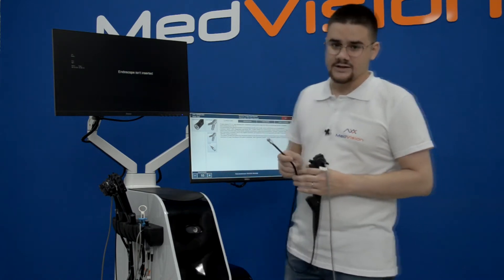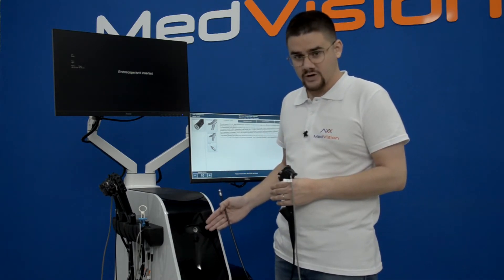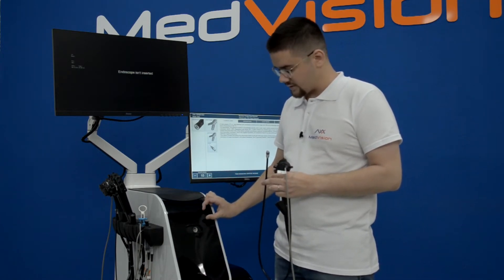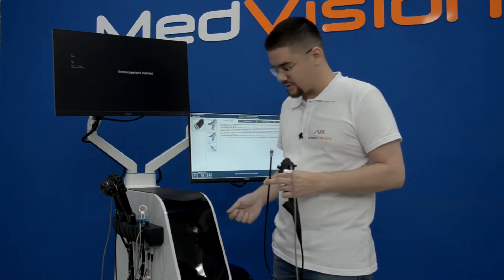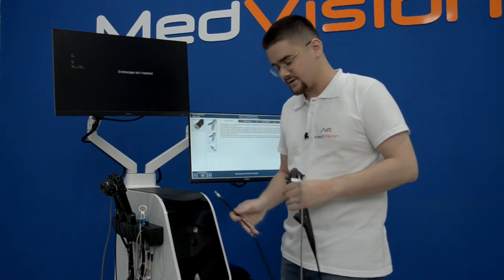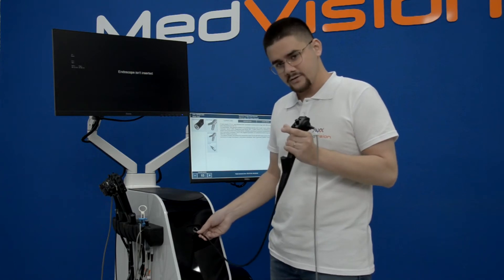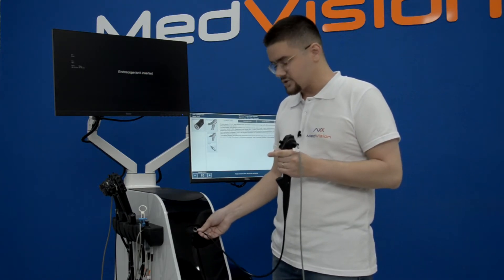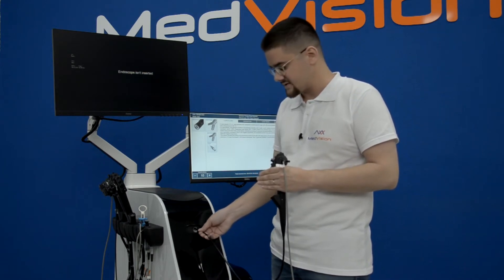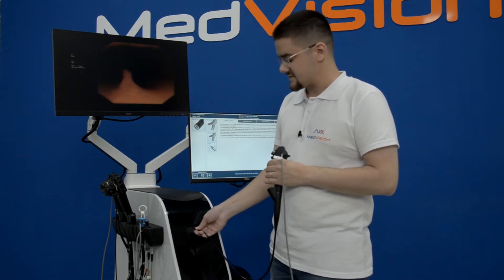When introducing the instrument into the universal port, there is a little trick: inside is a fixator that will grab the flexible part. You have to be careful when inserting and removing. As I insert I can hear an audible opening of the fixator. Push it further a little bit, then try to pull it out and you'll see if it's holding.